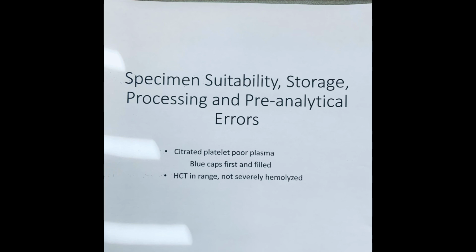One of the major pre-analytical sources of errors for hospitalized patients is collecting from a heparinized IV without adequately flushing it. Again, heparin at high levels will affect the PT assay, and heparin in general wants to be avoided if you're going to get high quality data from the PT coagulation test.